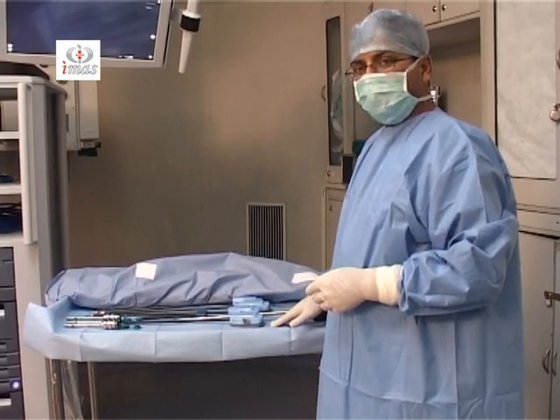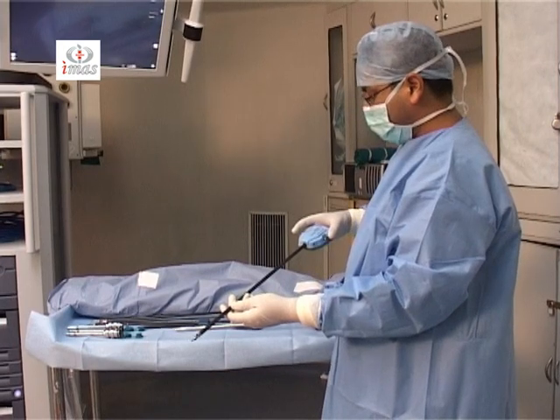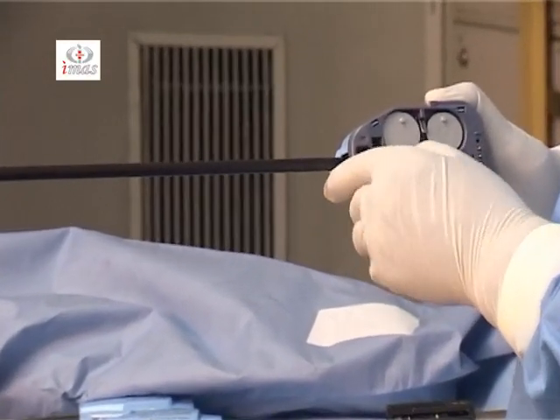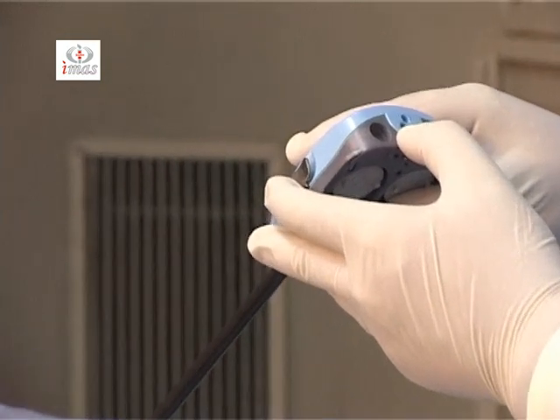Now this is the instrument trolley. These are the 8mm robotic endo-wristed instruments which can be turned with the help of these pulleys, and there are various channels to wash the instrument.